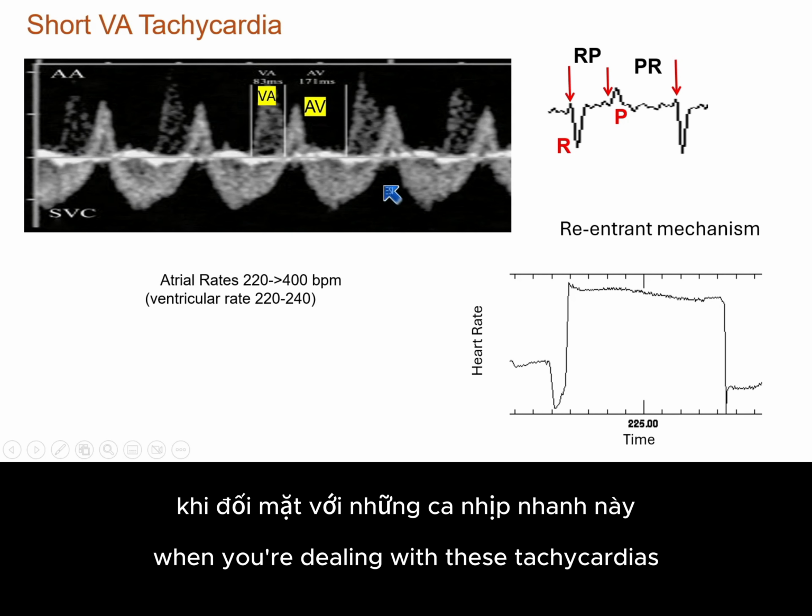Again, look how fast the atrium is beating, and sometimes if you just cover up the ventricles and look at the atrium and then do the reverse, you can tell the difference a little bit better, but this atrium is going much, much faster. The AV relationship is greater than 1-to-1.